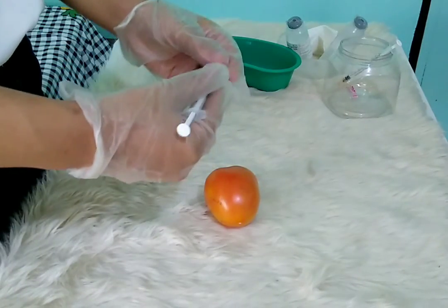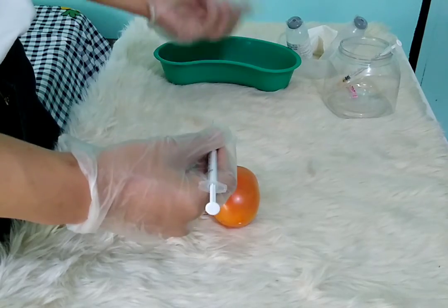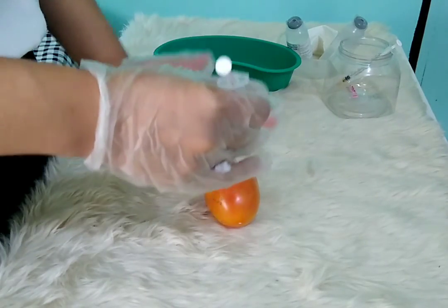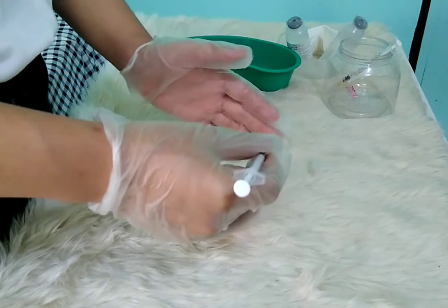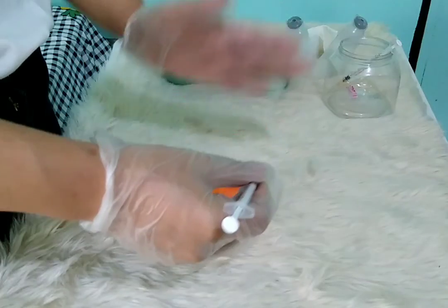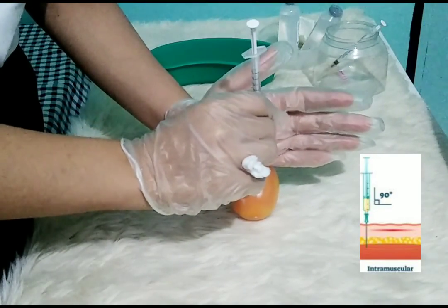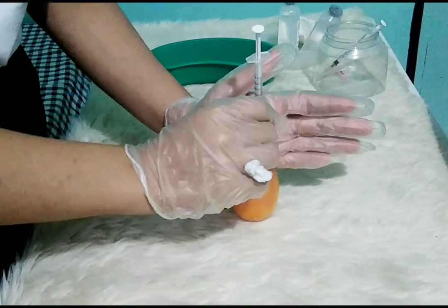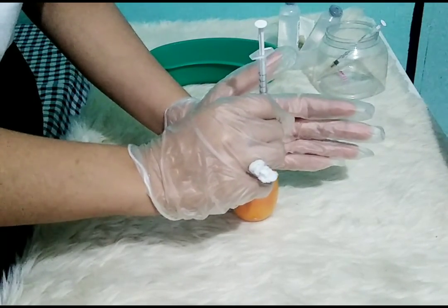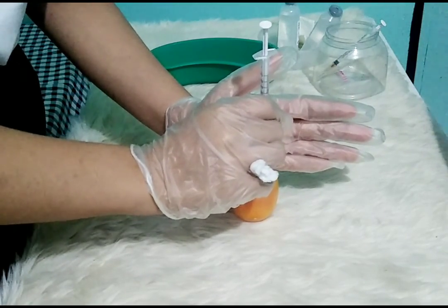First, remove the needle cover and discard it without contaminating the needle. And after that, take caution to avoid dripping medication on the needle prior to injection if using a prepared unit dose. Inject the medication using a Z-track technique. Use the ulnar side of the non-dominant hand to pull the skin approximately 2.5 centimeters to the side.